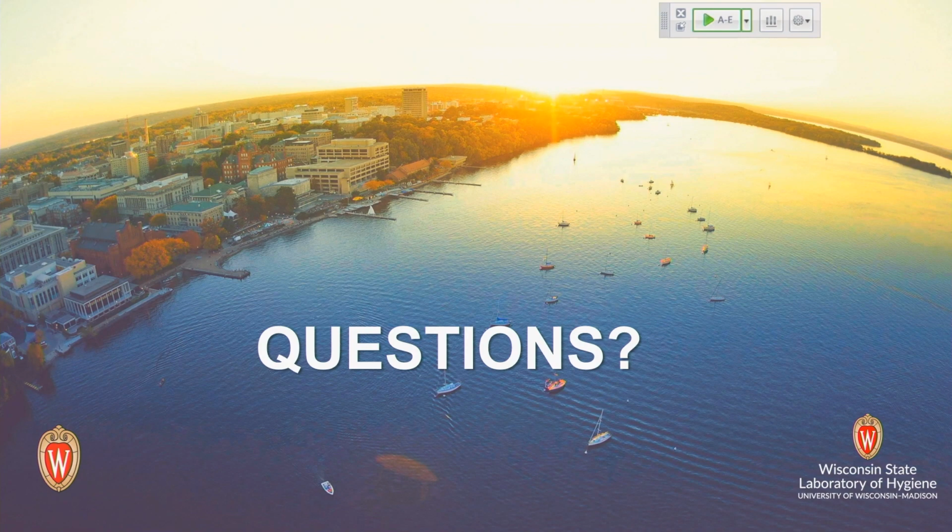Just a quick question on our BALs. We get a lot of them now with our new pneumonologists. We didn't used to get them hardly at all. But my question is, if you have a high percentage of your BALs that have like 3 to 5 colonies or 10 colonies of a yeast, like on 3 collections in the same person, or you get one colony of a mold here, one colony of another mold, it could be Aspergillus, it could be dematiaceous fungus, whatever.